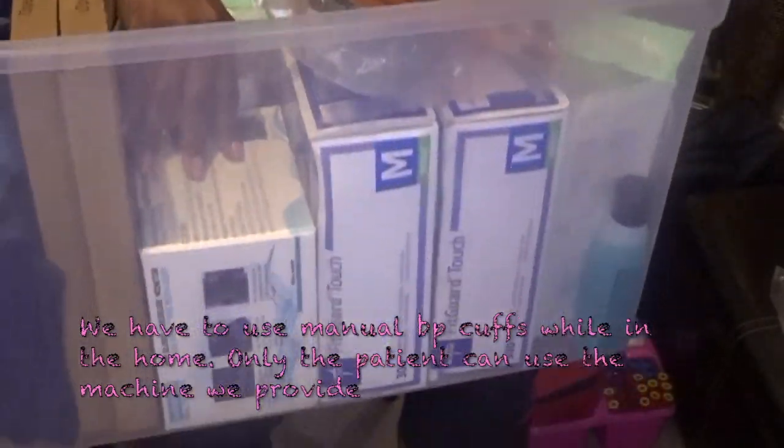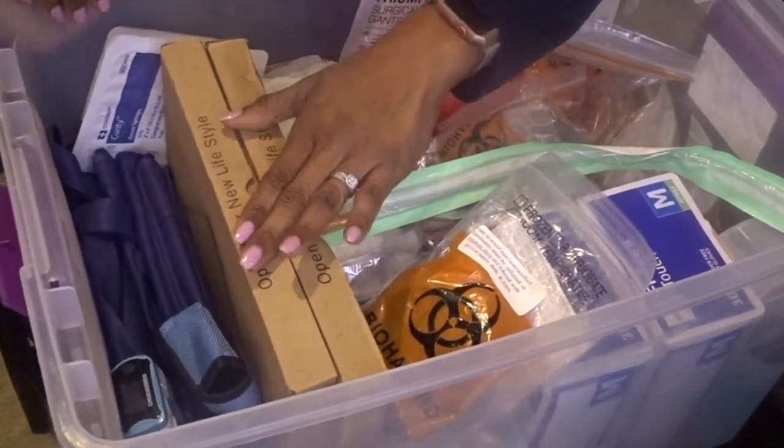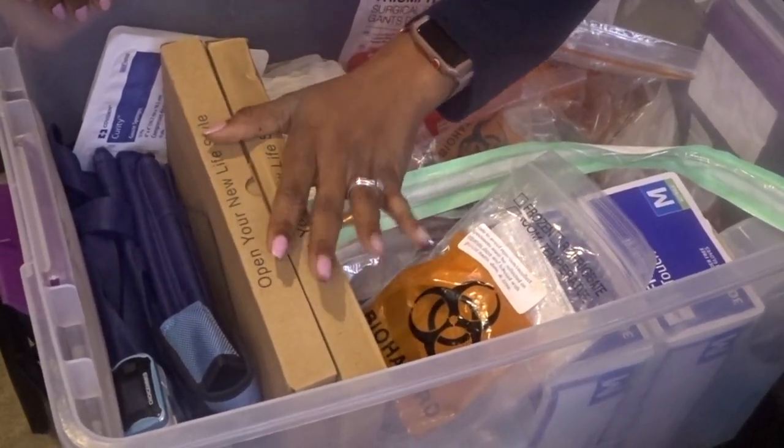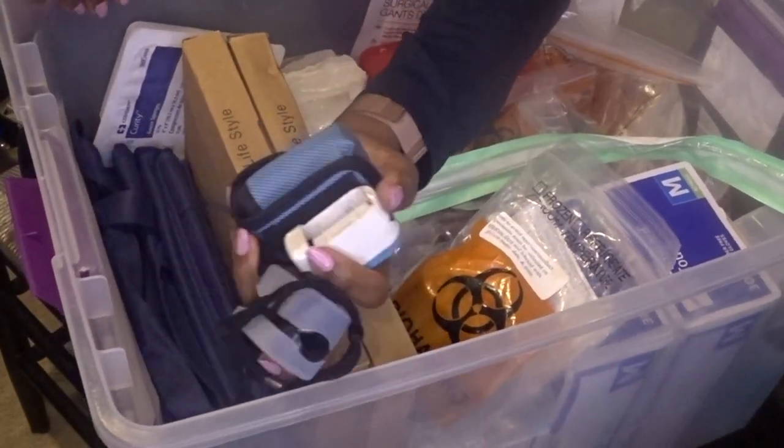There's a blood pressure cuff that we give to patients if they need it. We also give patients who have heart failure a scale if they need to monitor their weight and don't have one. And these are extra pulse oximeters that I have.